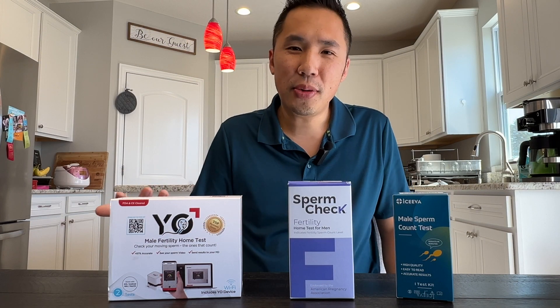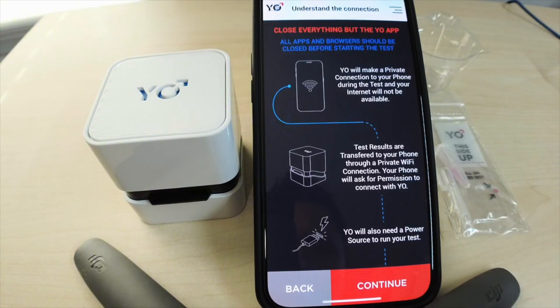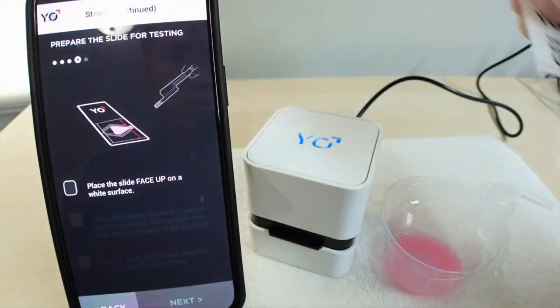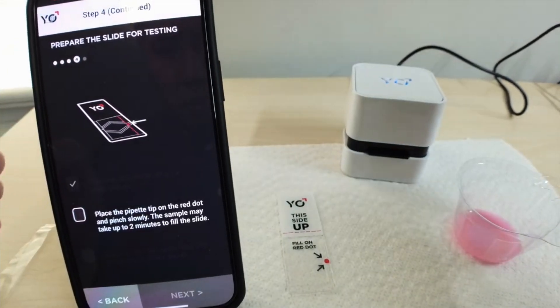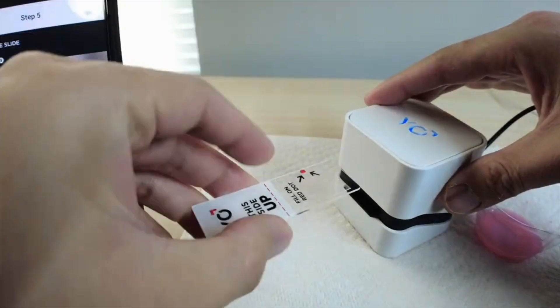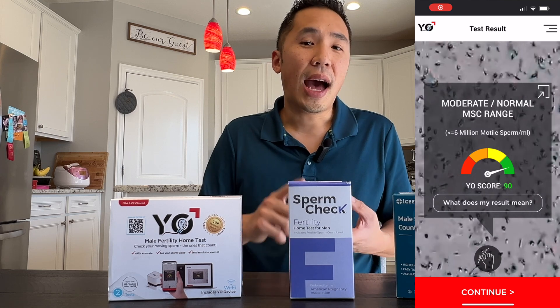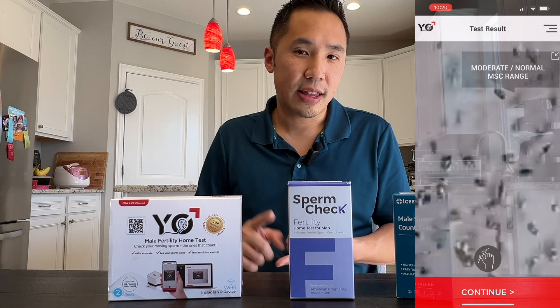The instructions are built into the application and they walk you step-by-step through the process. It comes with a slide where you add the sample after the prerequisite liquefying time and into the solution. You add it onto that slide and then insert it right into the device. After a few minutes, it analyzes and gives you that video along with a score of how it measures and ranks up against other men who have taken this test.